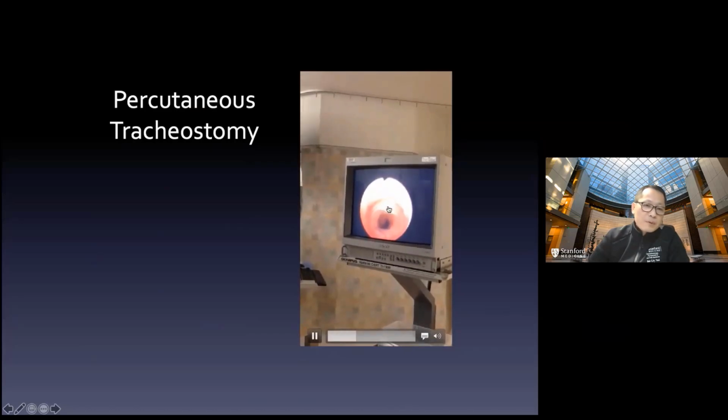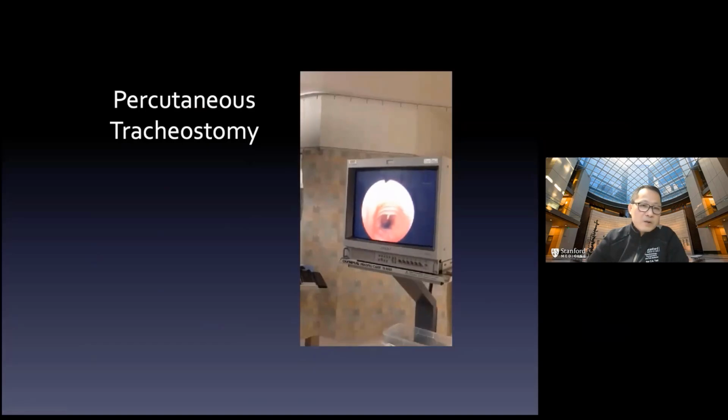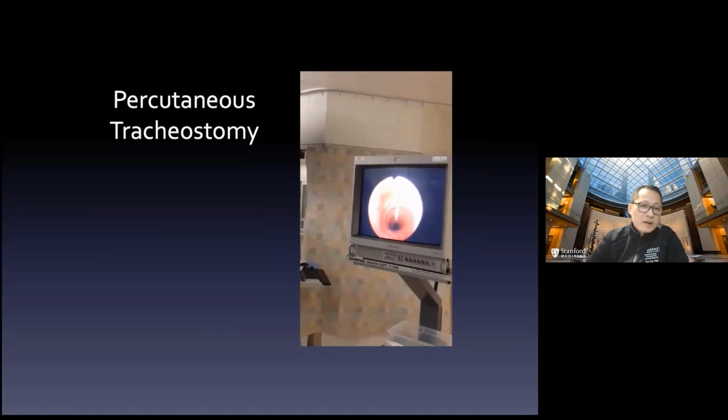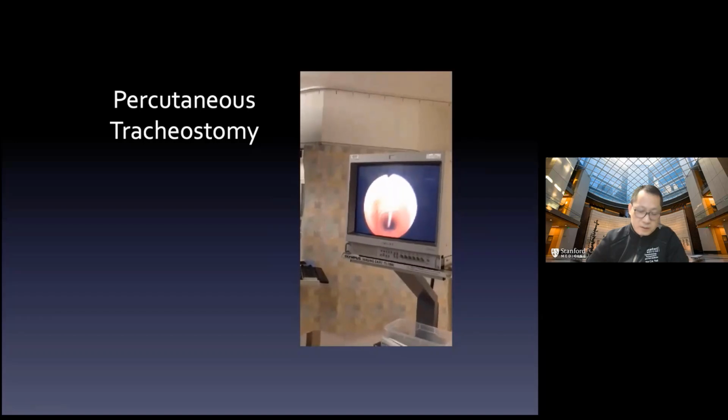and then we just pop it, but you can still hear the same philosophy: when the needle pops in, it changes tone to confirm it. And touching the side changes the tone again. So it tells you if your needle is too lateral or at the back wall.